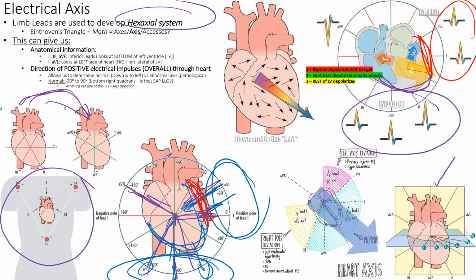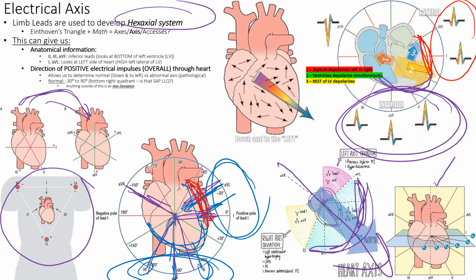All right, and of course our electricity that goes to the heart goes through this way. It goes through a big left ventricle. And sometimes your left ventricle is more beefy, so there can be a little bit of deviation. So that's the normal progression of electricity through the heart, and we can pick that up on the 12 leads. And we can see, of course, these are positive complexes because it's going down towards it. And you might get a little bit more biphasic in lead 3 because there's a lot more positivity as we're going towards the left side.